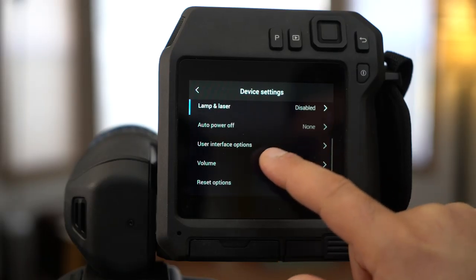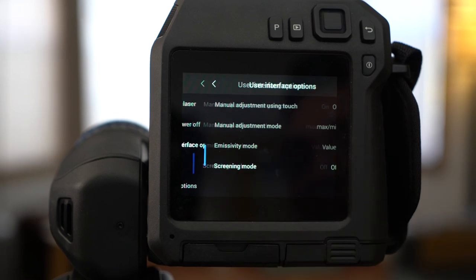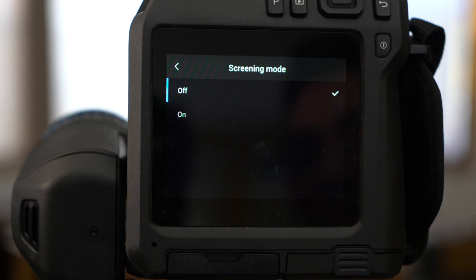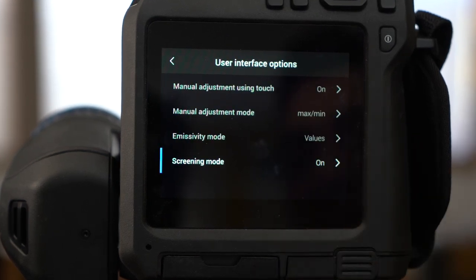Next, scroll to user interface options and tap to enter the menu. Now select screening mode and enable it by tapping on.